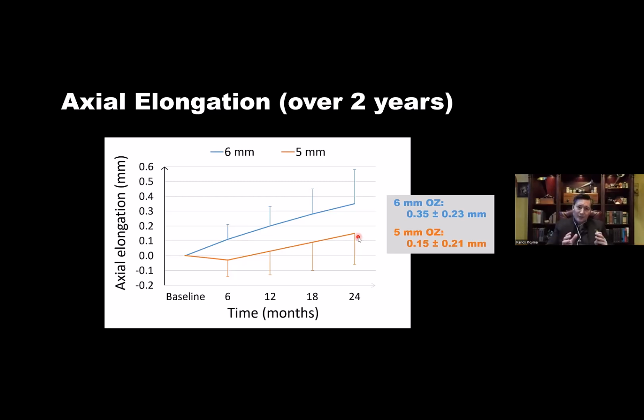Remember in the beginning, we said that 50% eye growth reduction is the average of most of the studies that have been performed in Ortho-K, all of them using about a 6 millimeter optic zone. So simply by going smaller, we can increase the myopia controlling effect, getting almost as high as 80% less eye growth.